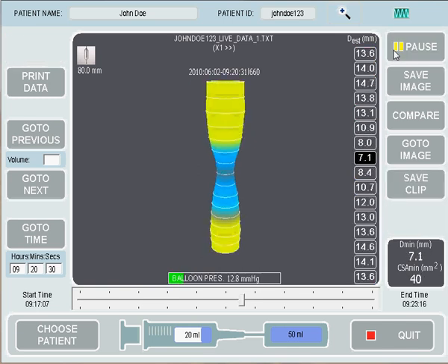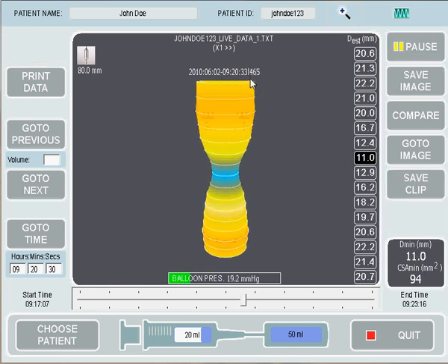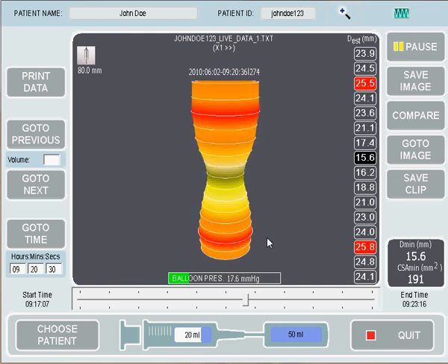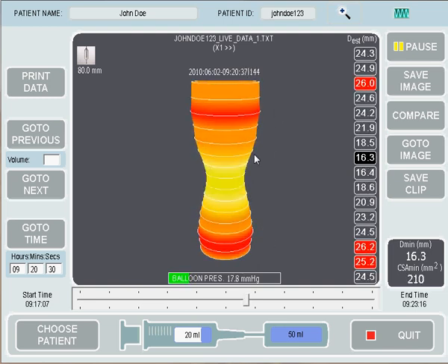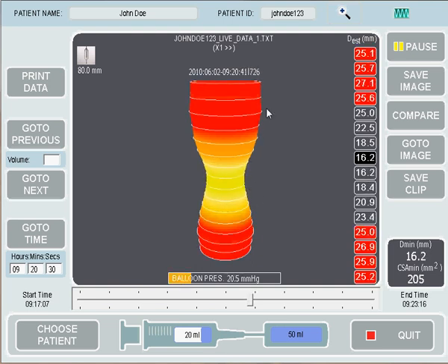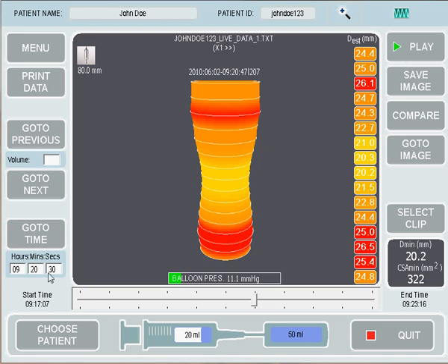So if we play from this time of 9:20:30, you'll see we have a nice smooth image on screen with a nice hourglass shape and very little movement. The reason for this is that the filtering option is on, as you can see by the icon up above.